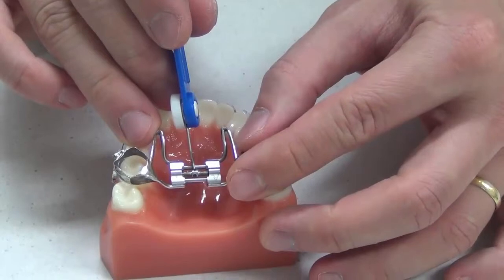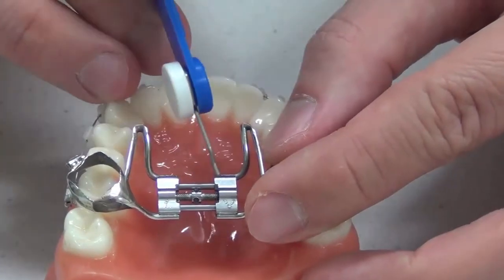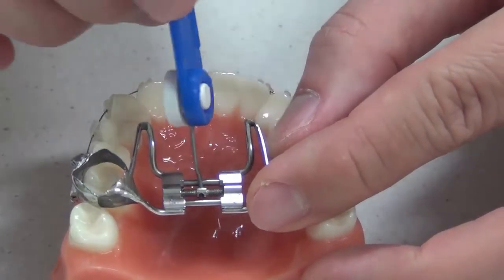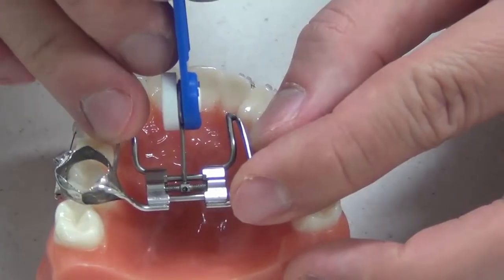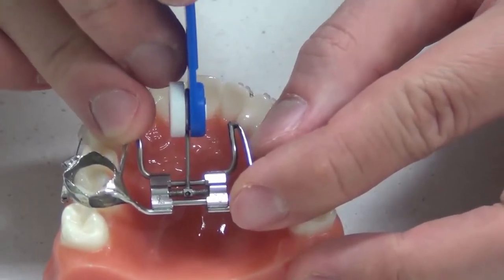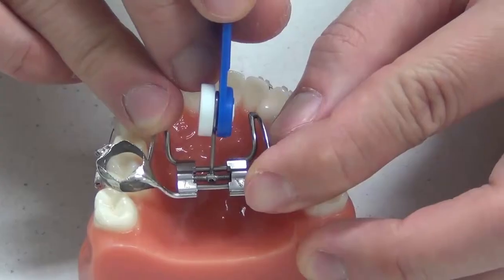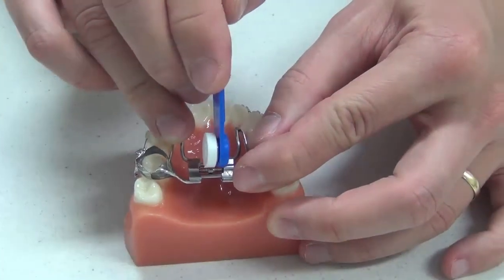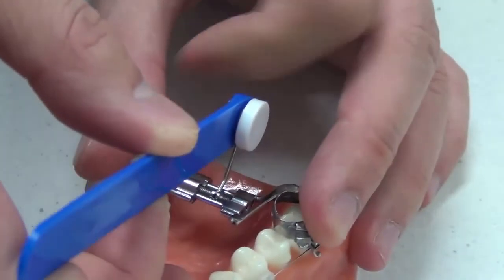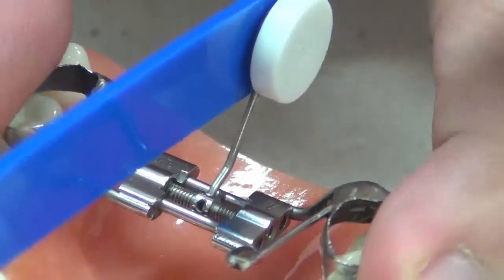To place this key in, line up the handle so that it's parallel with the middle of the wheel — you don't turn it from an angle, you line it parallel. Then gently rotate it so the key goes in right to the very base of that wheel. Make sure you have a bright light, such as in the living room or with a bright bedside lamp. Once the key is in, turn it and push back all the way until you see the next hole appear, and that's when you remove the handle.